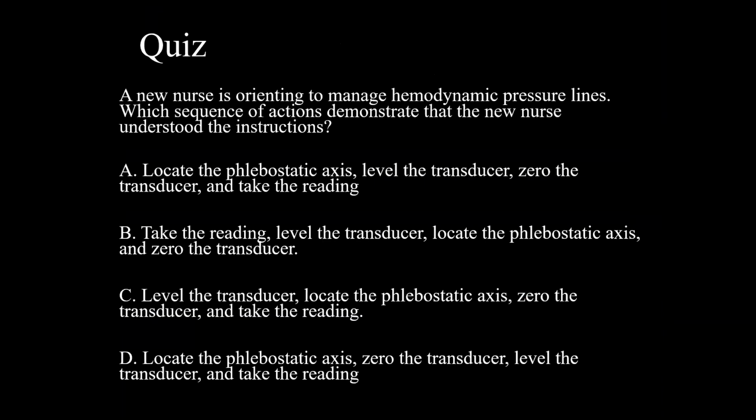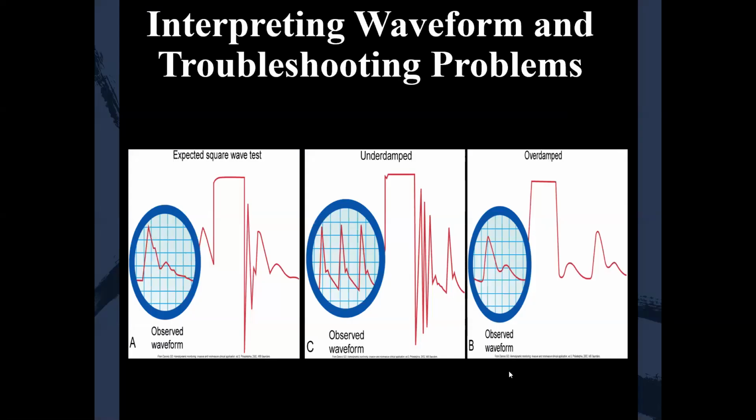With all three of those, we're focusing on after the square wave, after that flat line. The blue that's circled, we don't really have to focus on right now. The blue section where the peaks are, we don't have to focus on that. Well, you should, because that's your actual waveform that you'll see on the monitor before you start doing the square waveform. It should go back to where you started, so you could compare.